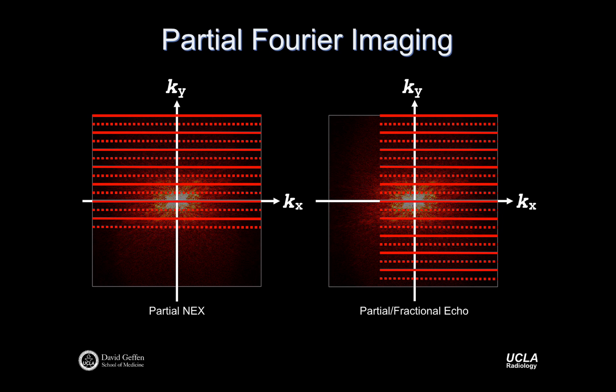But in terms of the gradients, remember the gradients move us around k-space. Let's just think about this middle k line where there's no phase encoding happening. So now we're just thinking about the readout gradient. I'm going to draw a readout gradient for conventional gradient echo, and it looks something like this, where if this was area A, then this is area A, and this is area A. In k-space, that meant I would move out a length, little a, and then I would turn around and go the other way, a distance A and a distance A. So this is the gradient waveform that corresponds to that trajectory, and that trajectory would be, say, acquiring this line here. So how do I do that?